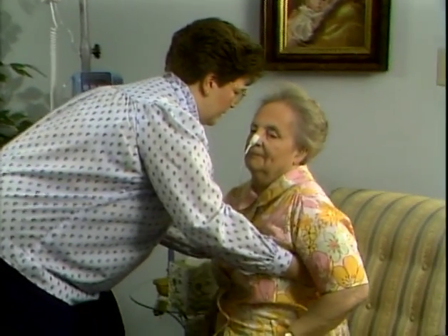After checking the gastric residual and placement of the tube, it is time to administer the feeding. We have already discussed how to prepare the formula for administration using aseptic techniques. Here are some other points to remember. Before administering the formula, Linda assists Agnes to sit up in a chair. Agnes could also be sitting in bed, with the head of the bed elevated at least 30 degrees.